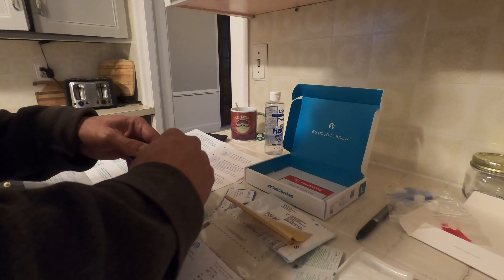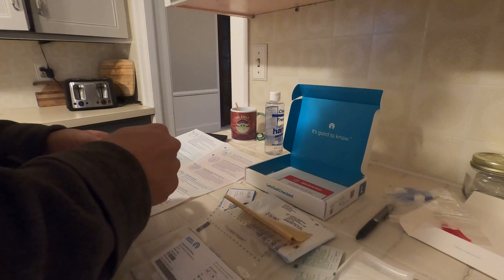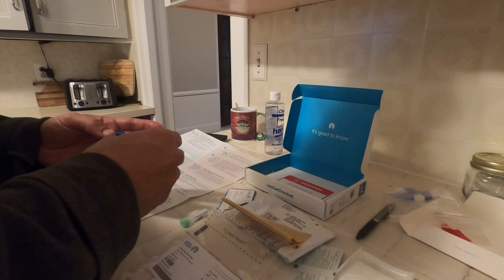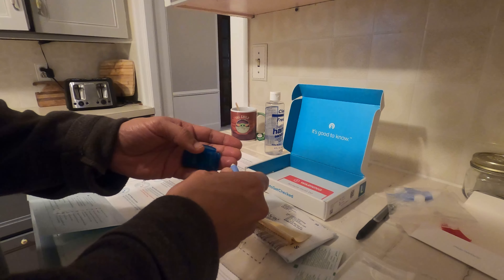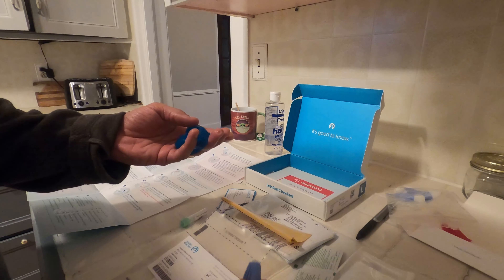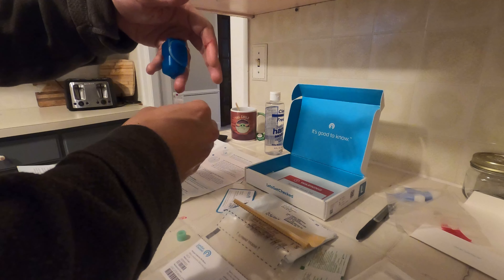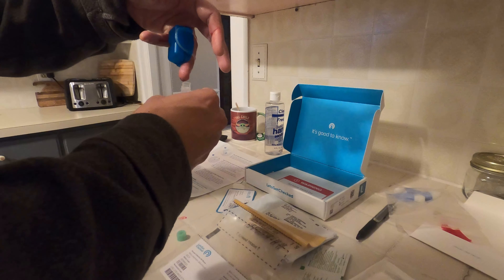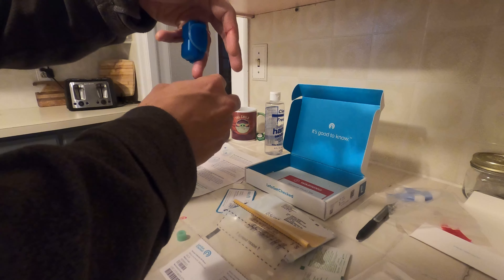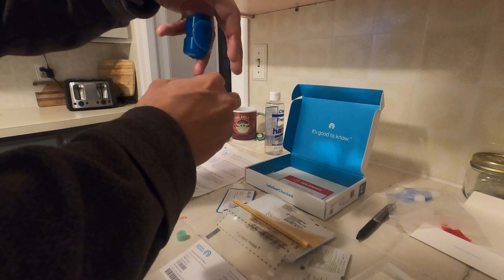Once the time frame came up I used the first lancet, and I ended up having to use all four of them — my fault, because I wasn't proficient in taking my blood sample and I didn't fully follow directions. I needed to take my time. The pain level was not high at all; it was actually less painful than when a technician takes blood at my local physician. What you see here is me emptying the blood into the sample tube — you contact the blood on the side of the tube and let it empty in.